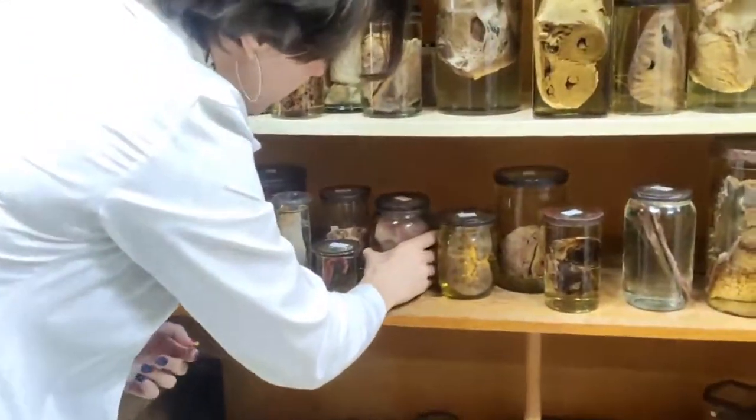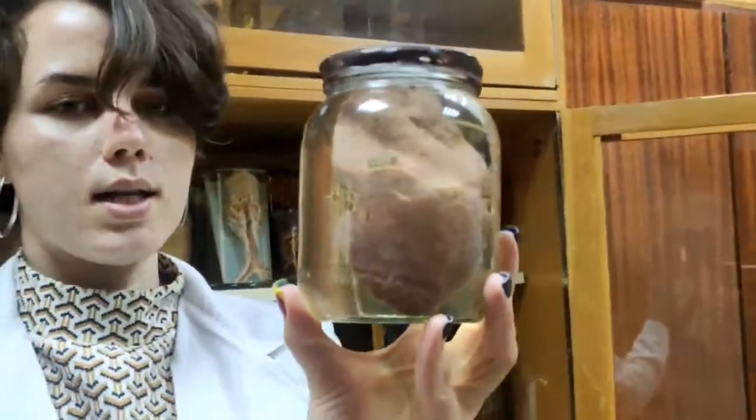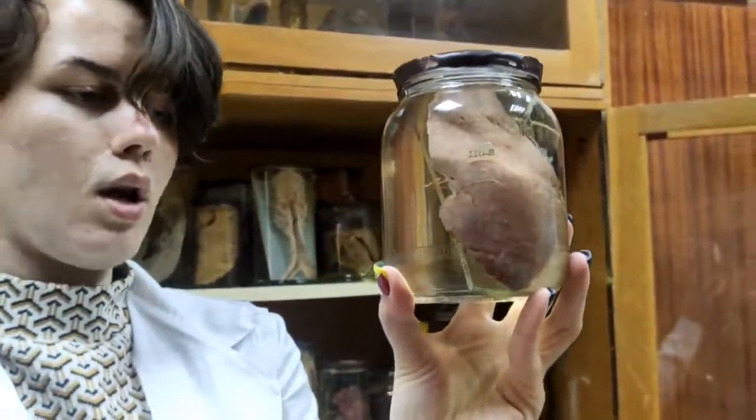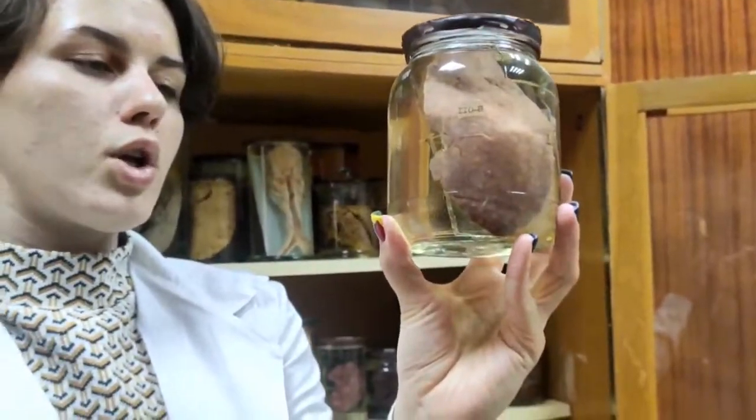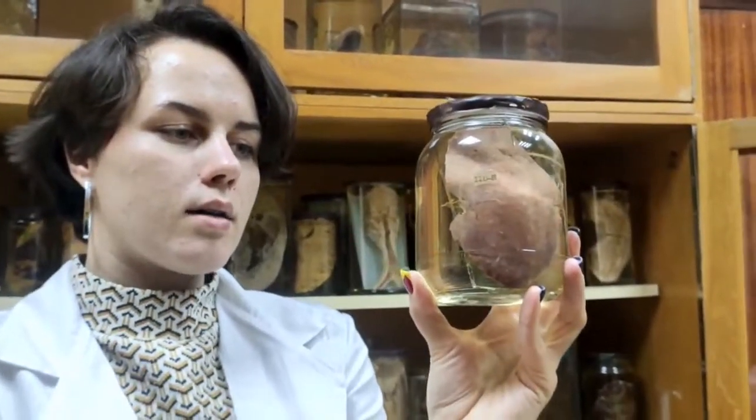Okay, the next one is acute pyelonephritis. Acute pyelonephritis is acute inflammation and infection of the kidney and urinary tract. Pay attention that glomeruli are not affected, because if it is inflammation of glomeruli, we will call it glomerulonephritis. And here we see only involvement of urinary tract tubules in the cortex.